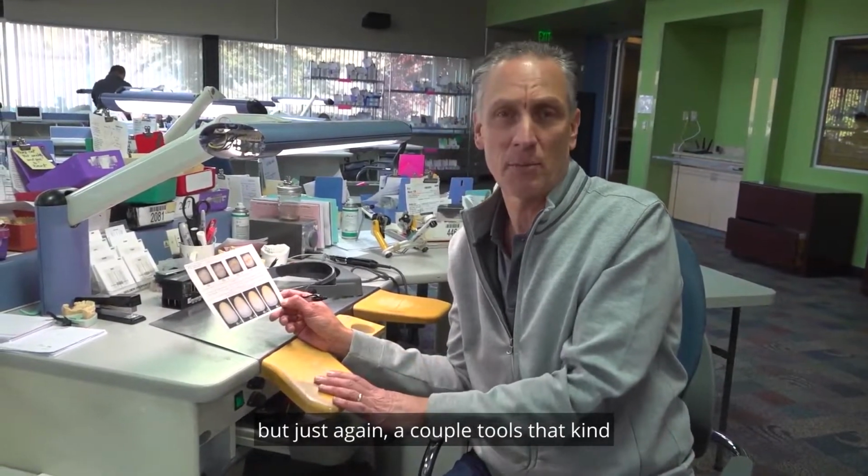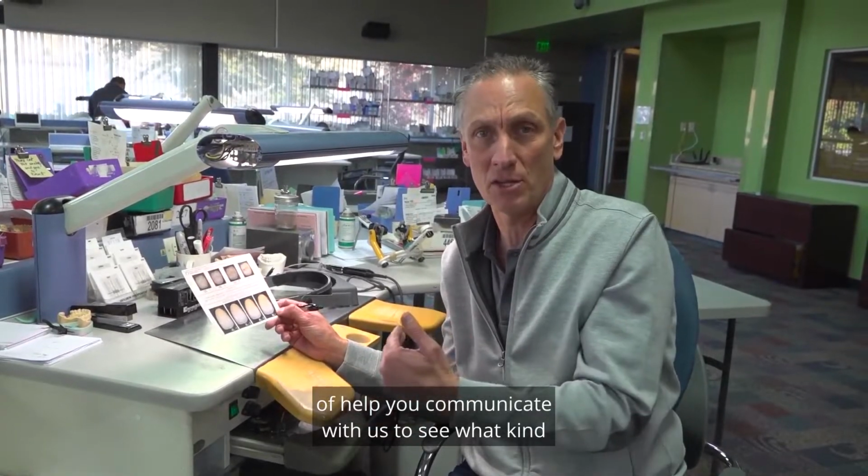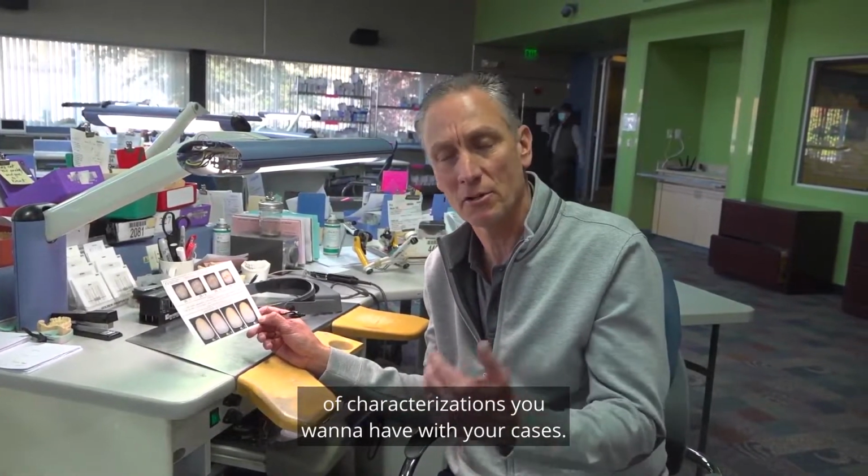But just again, a couple tools to kind of help you communicate with us to see what kind of characterizations you want to have with your cases.